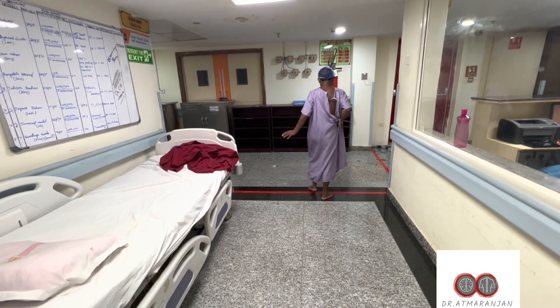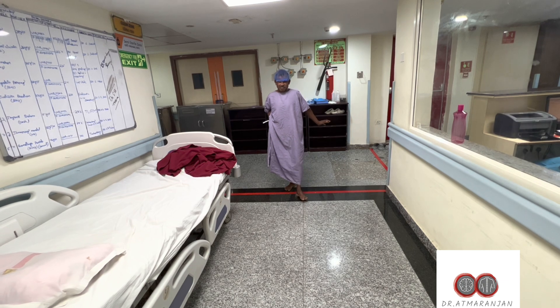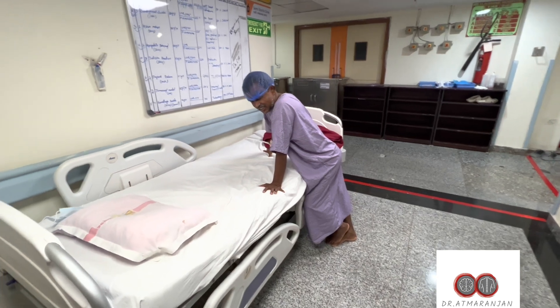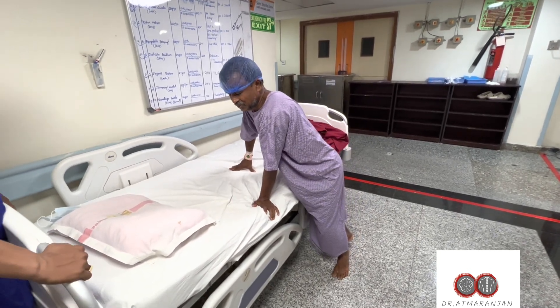We planned endoscopic spine surgery under local anesthesia. The key advantage is that we can get real-time input about the patient's pain and motor response. This is a daycare procedure, and the patient is in significant pain, requiring support to walk at this point.